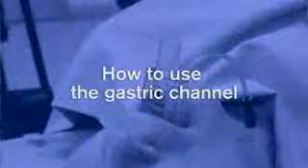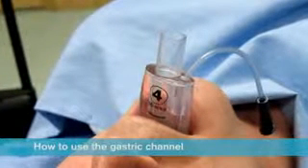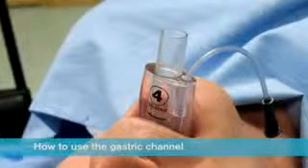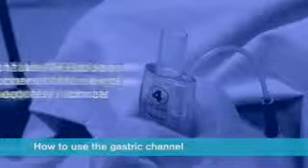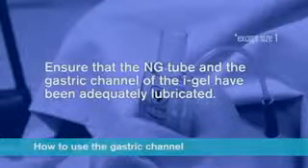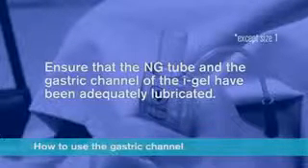How to use the gastric channel. If required, a nasogastric tube can be inserted down the gastric channel of the iGel. For a quick and efficient insertion, it is important that the nasogastric tube and the gastric channel of the iGel have been adequately lubricated before insertion is attempted.